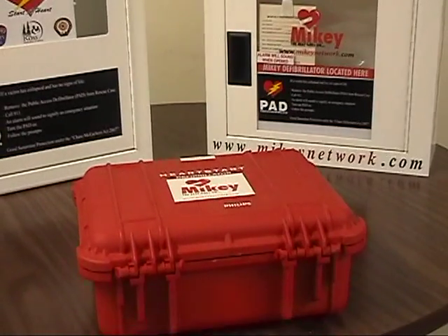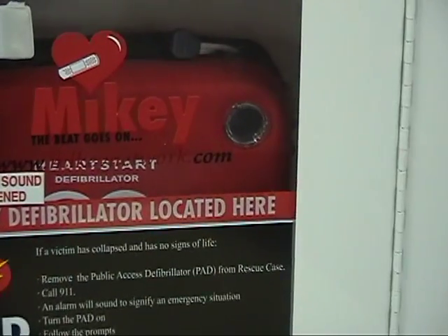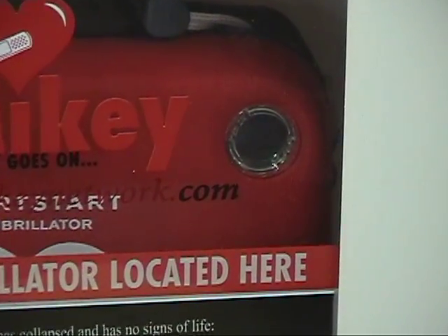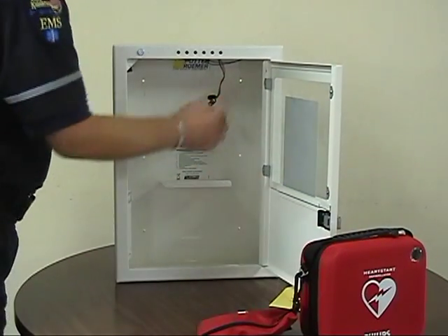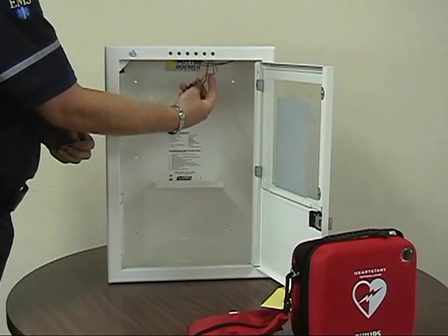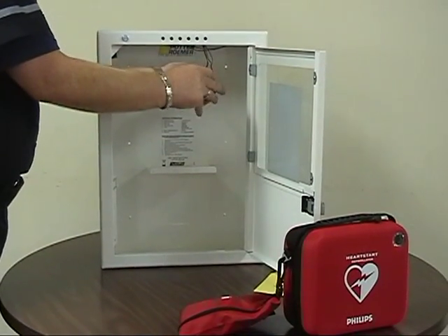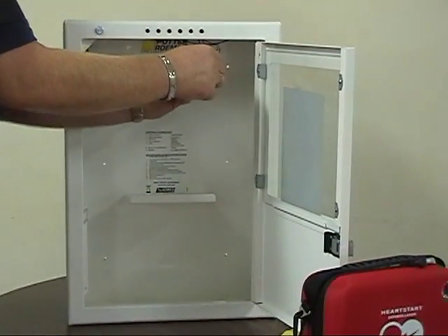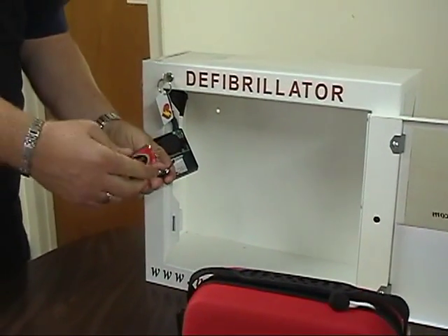Check that the green light in the public access defibrillator is flashing — that means it's operational. If your AED is wired to an alarm company, have it taken offline. Replace the 9-volt battery or batteries. There are two located in the large white case inside the top area, and on the small white case on the left side of the case, you will notice that it takes one single 9-volt battery.